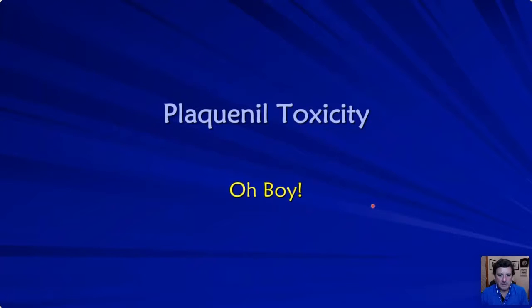Having fun with these patients. So let me talk about Plaquenil toxicity real quick, with COVID being out there and Plaquenil and hydroxychloroquine potentially being a part of the treatment, and patients with rheumatoid. On OCT Connect, people are like, oh yeah, there's no such thing. We talk about it all the time. There have been papers put out. I've never seen it.